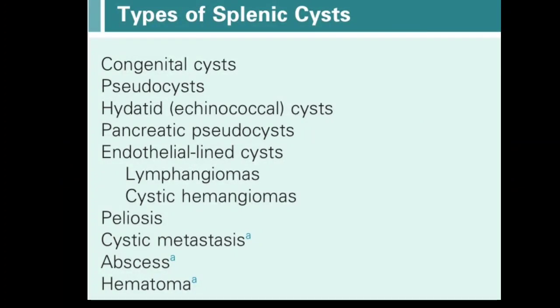This list shows the types of splenic cysts which you can easily appreciate on ultrasonography. We will discuss all these cysts separately, with their particular ultrasonic features, later on. But it's just for the start, so that you have the idea of how many types of cysts you can appreciate on ultrasonography.